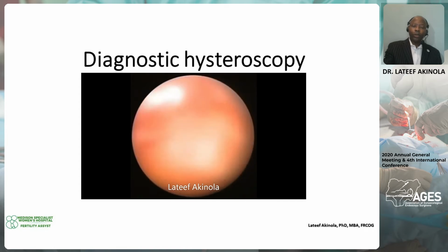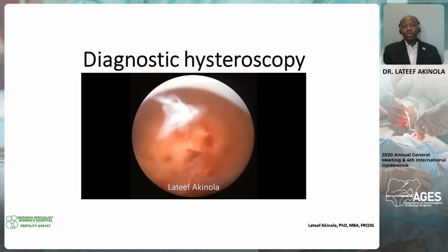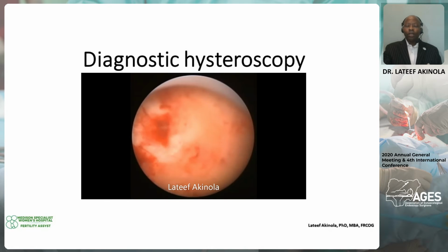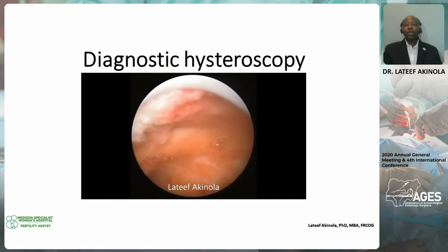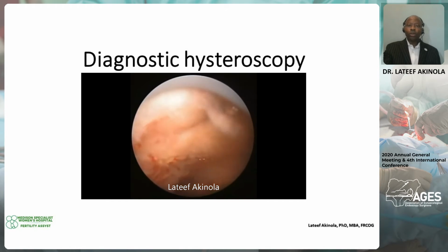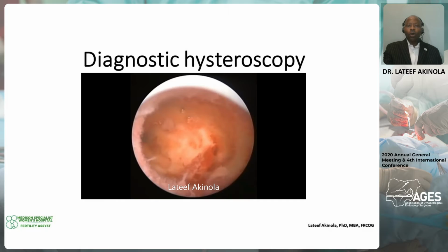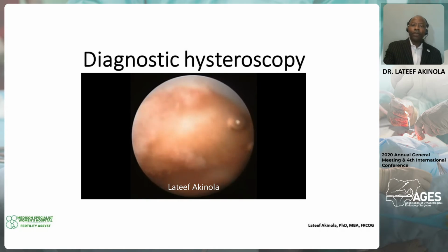This is diagnostic hysteroscopy, and mainly what you are trying to do is to examine the endometrial cavity for pathologies, have a good panoramic view of your cavity, and check that you can see the two ostia simultaneously. Look at the anterior wall, posterior wall, the two lateral walls, the two ostia, rule out fibroids, and then when you are coming out, gradually withdraw your hysteroscope, examine the internal walls, examine the cervical canal, and also the cervix itself and the vaginal wall. Finally, have a good view, check there are no fibroids, and then you can be confident there is no pathology here.